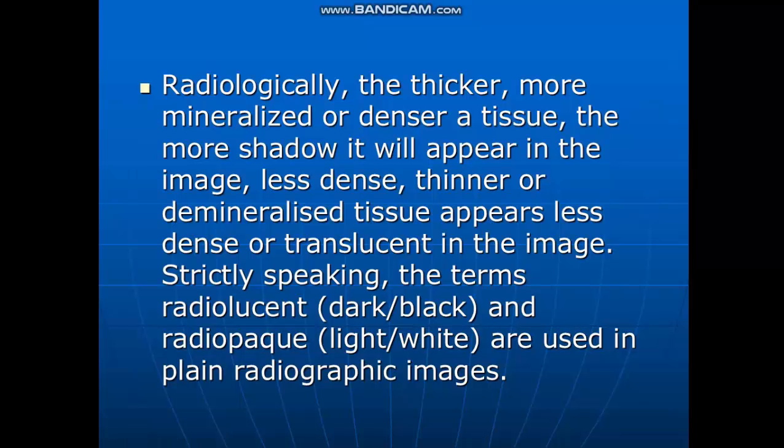On radiography, the thicker, more mineralized or denser the tissue, the more shadow it will show in the image, but less dense, thinner tissue appears as translucent or transparent.